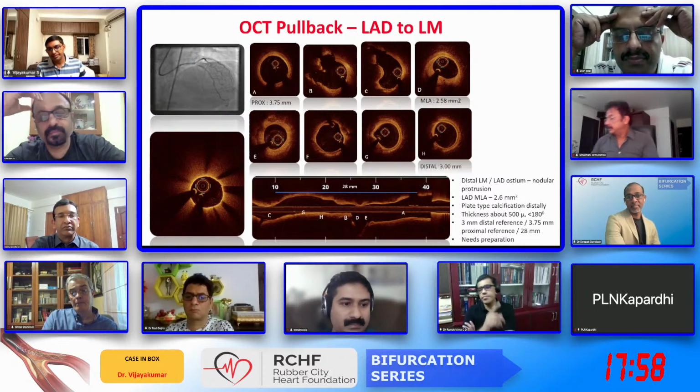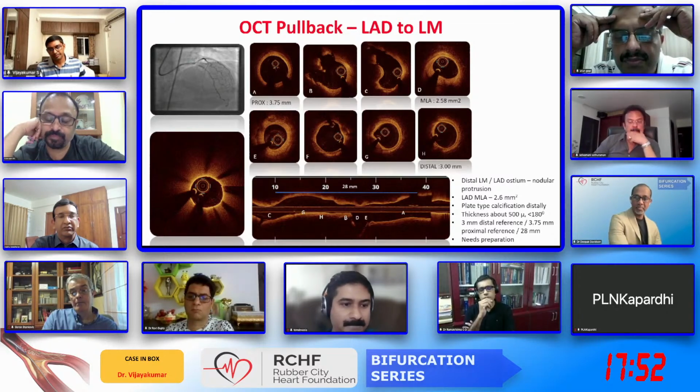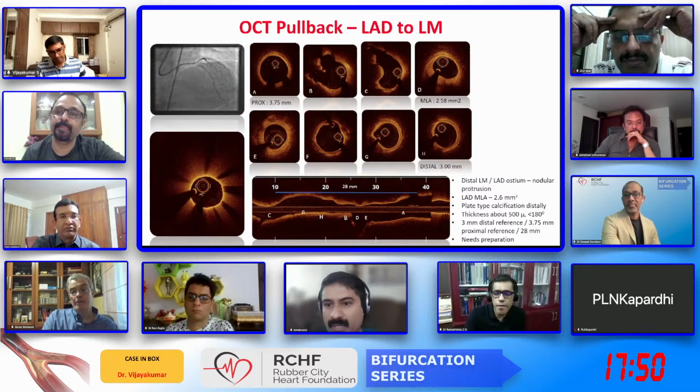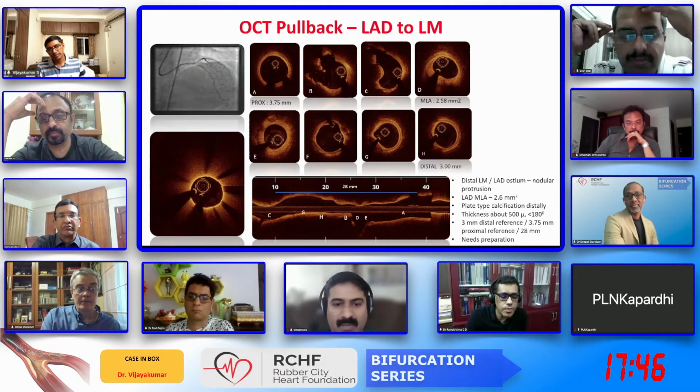Yes, sir. Is he talking about static rotablation, Dr. Tom? Yes. Okay. But Vijay, I would like to know the opinion of Dr. Goran. What does he do if there is a circumflex ostium with significant calcium?